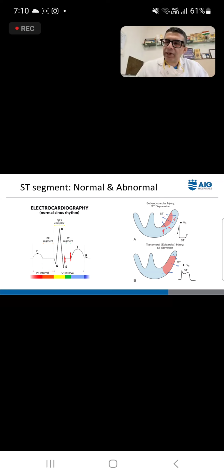That means the current from the epicardial side goes towards the endocardial side, because only part of the myocardium is ischemic now. So when you have a lead here, we said whenever the current is going away from the lead, it will produce an ST depression. So if you put a normal baseline and the ST has come down here, this is the extent of ST depression.